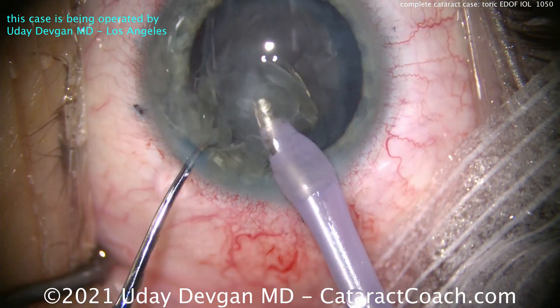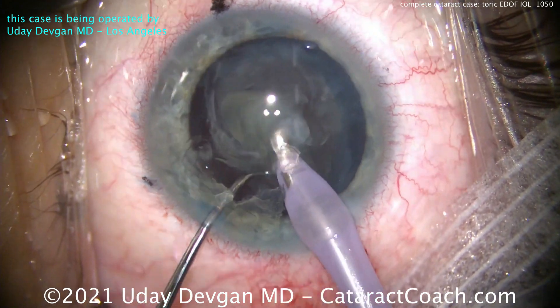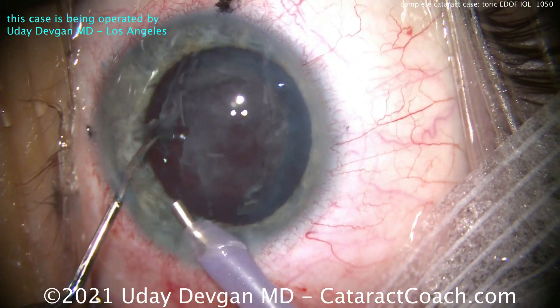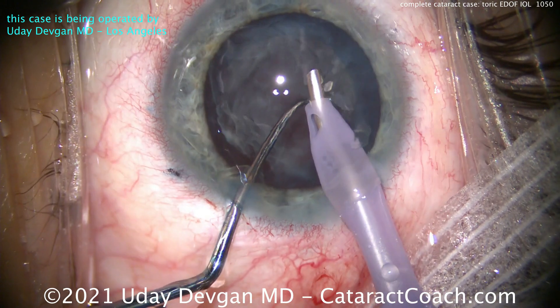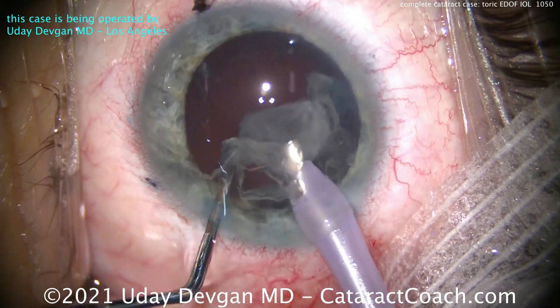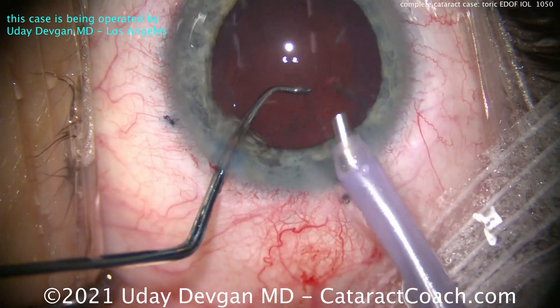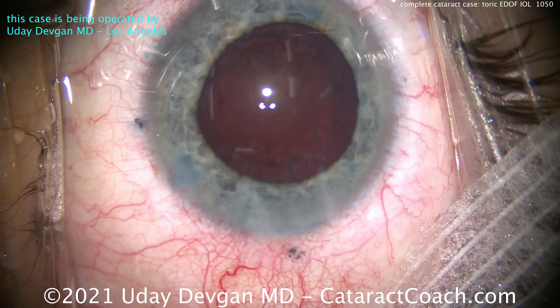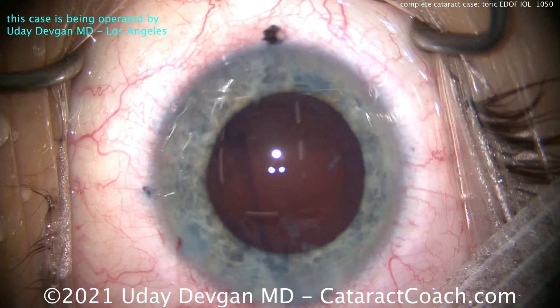The patient has a history of hyperopia in both eyes, astigmatism in both eyes, and anisometropic amblyopia. This eye that we're operating on is his better eye. The lens power ends up being 25.0 diopters. His other eye, which is yet to have surgery, is going to need a 29-diopter IOL for the same outcome of emmetropia.